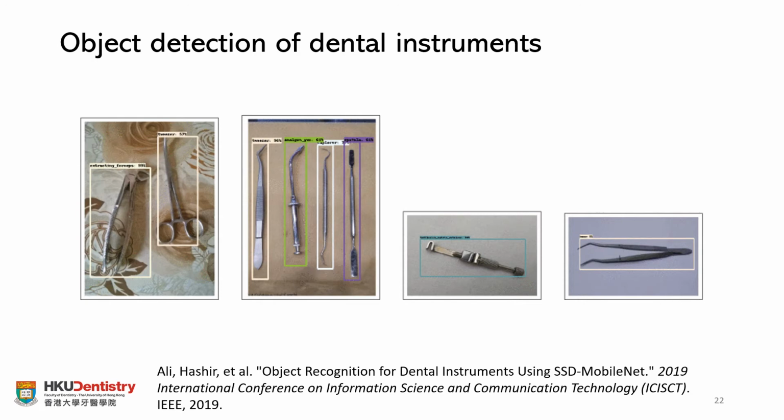You can see as an input, you can give the image of the instrument, and the output, the model can predict what type of instrument that is, and what's the location of the instrument in the image. So somehow it can be interesting for some downstream applications.